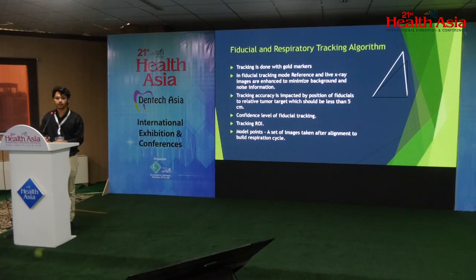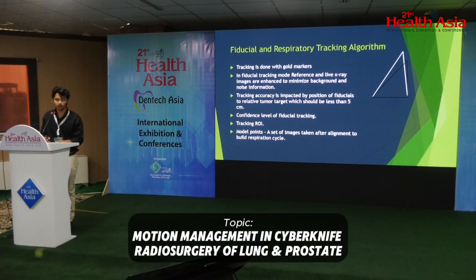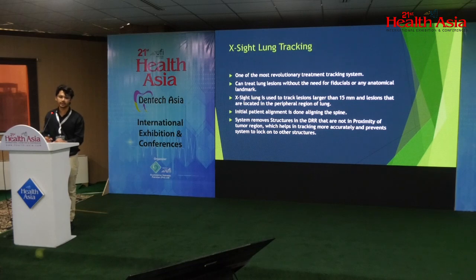Modeling points. When we record the respiration of the patient, we take images from the point of complete exhale to the point of complete inhale, so that we know that the complete respiration of the patient is being recorded. And along that cycle, multiple images are taken.